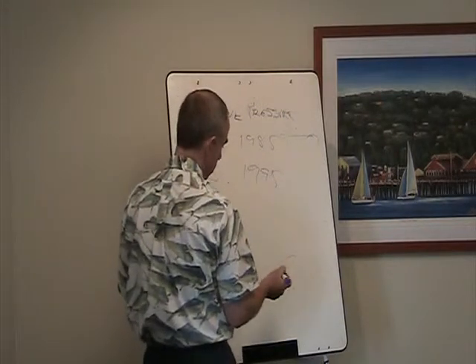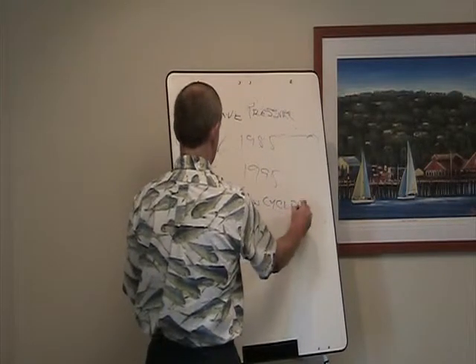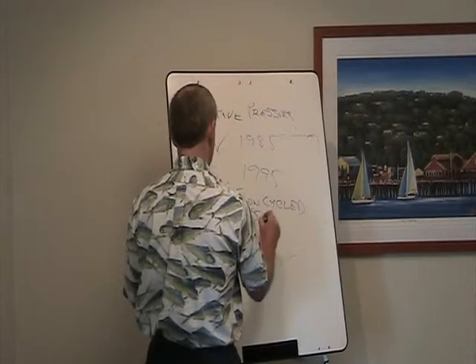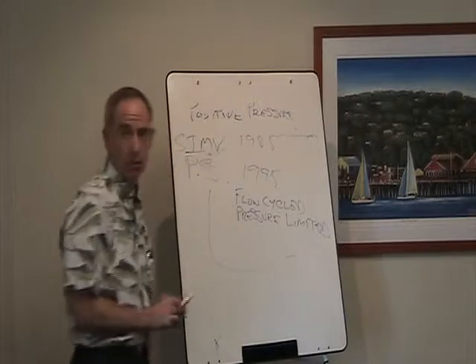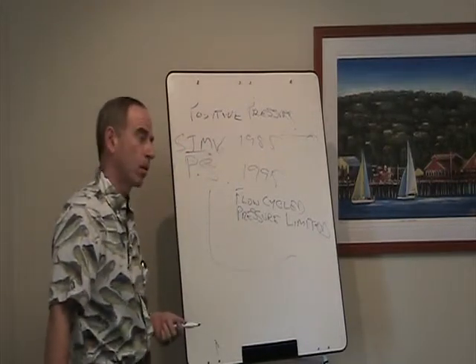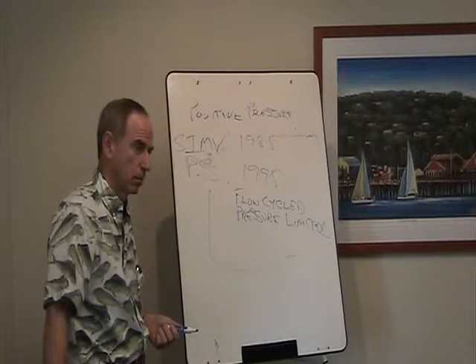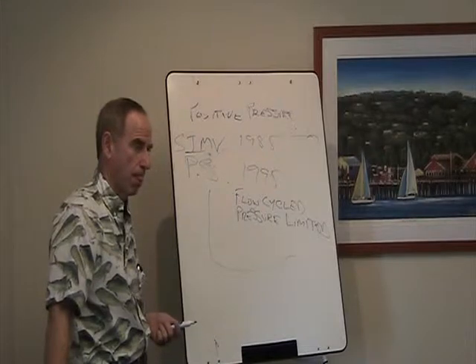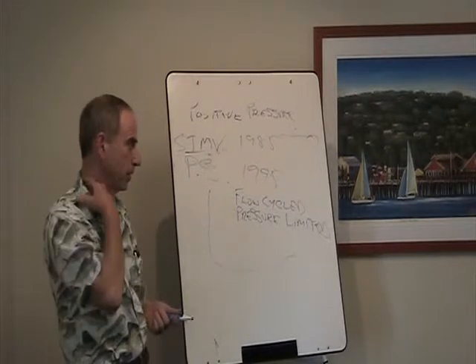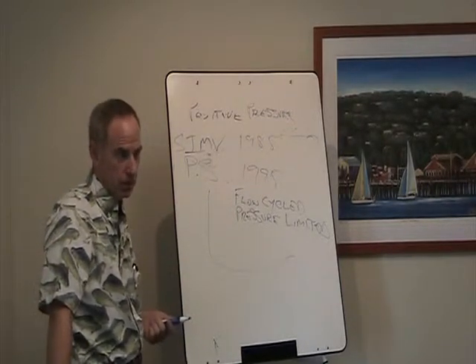Pressure support is a flow cycled, pressure limited ventilation. What does that mean? It offers an amount of pressure at a certain time. But maybe I don't understand, right? Pressure support, is that the same as tube comp, in the sense that it's given a certain amount of pressure? It's probably a type of pressure support. Okay. It's a variable pressure support, essentially.